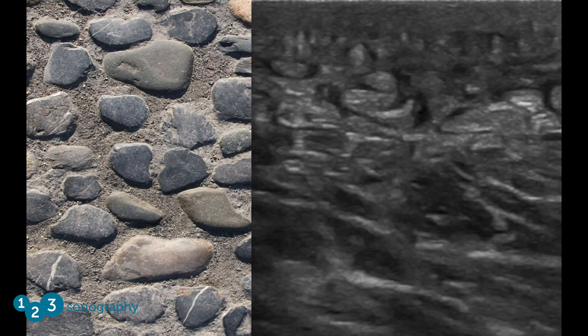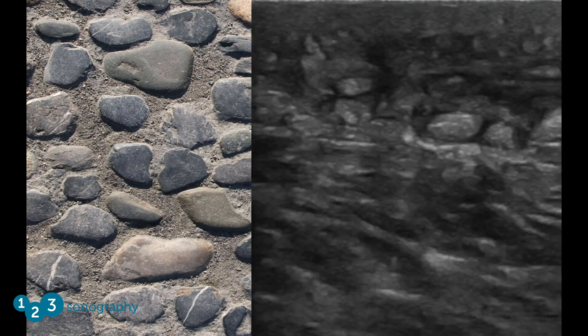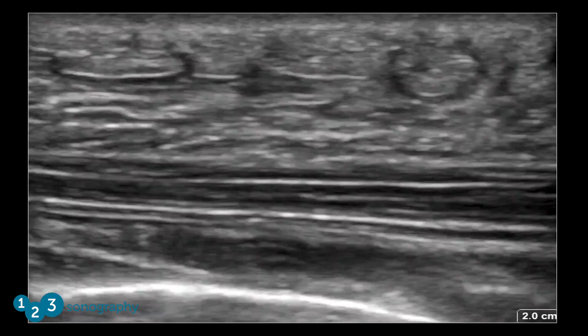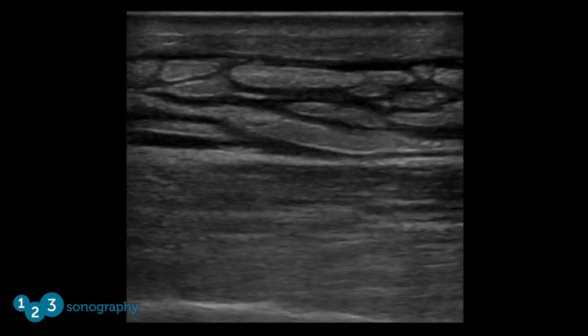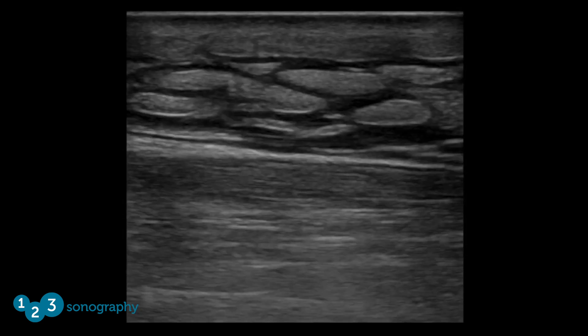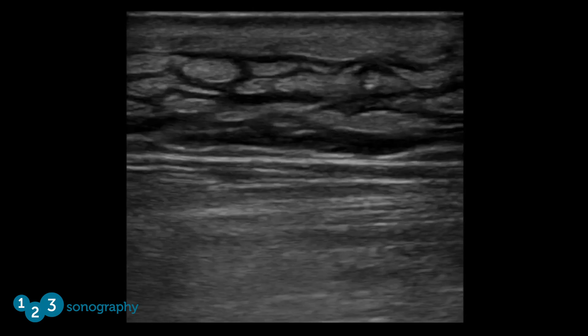Here are additional examples of cobblestoning. Notice how the pattern is different in each one.